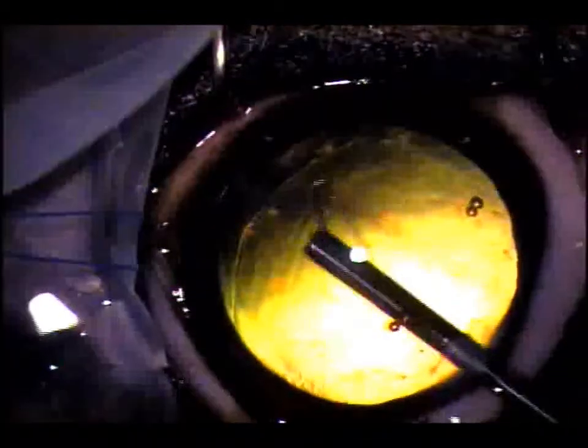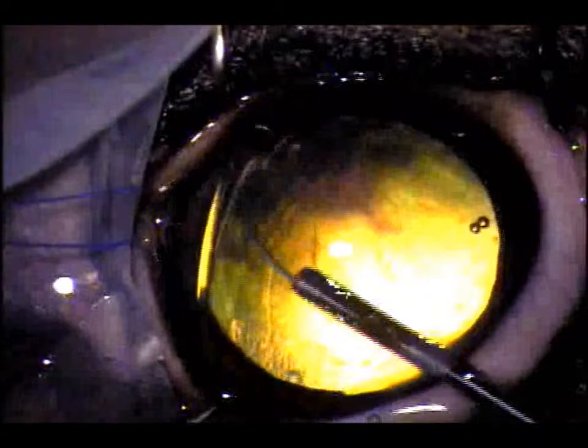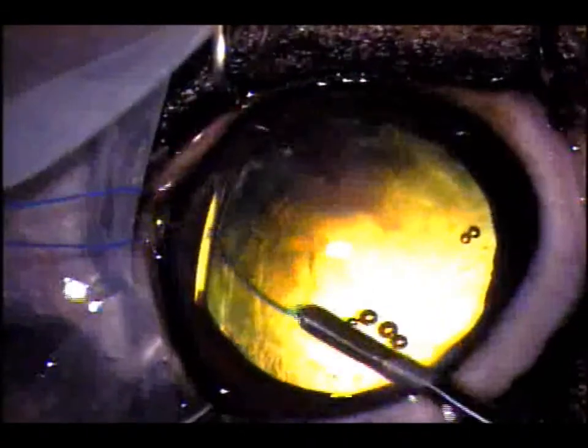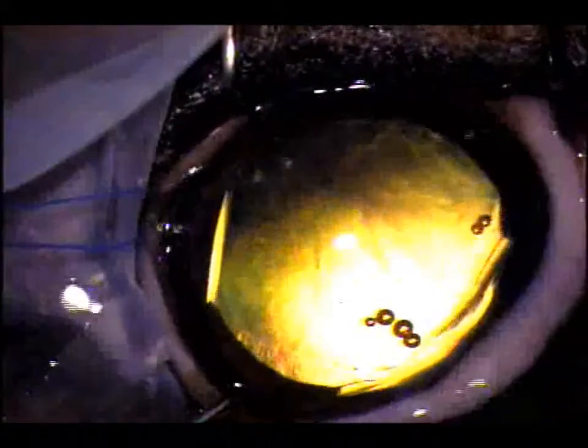For this we implant a capsular tension ring, which is an intraocular device, a ring of acrylic essentially that expands into the lens capsule peripherally and provides 360 degree tension around the lens capsule to keep it in place.